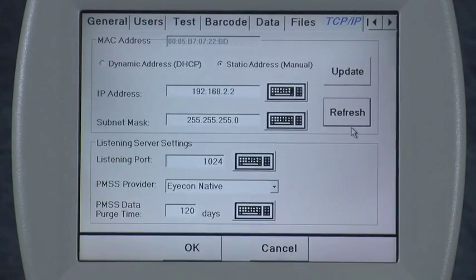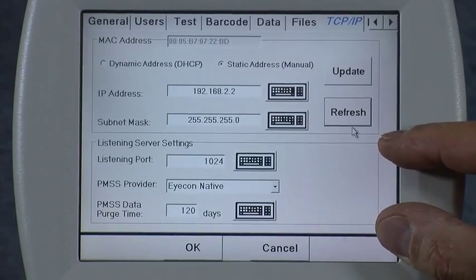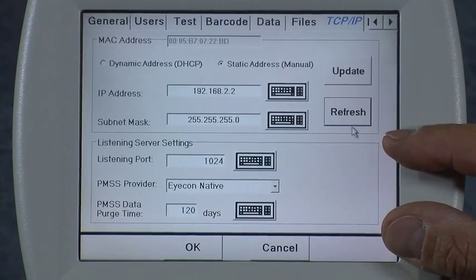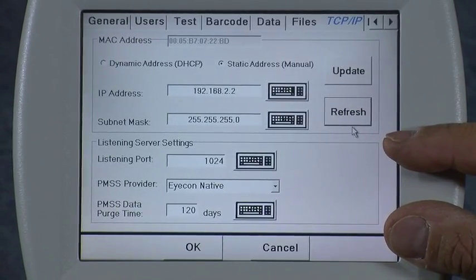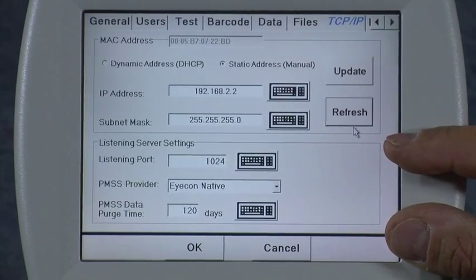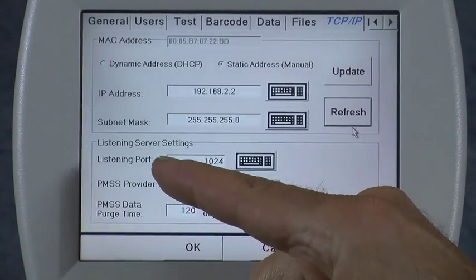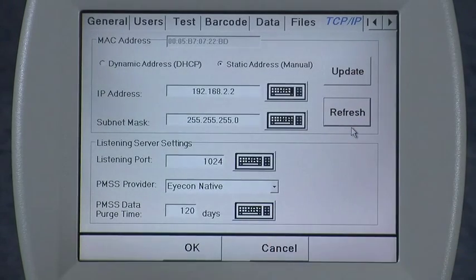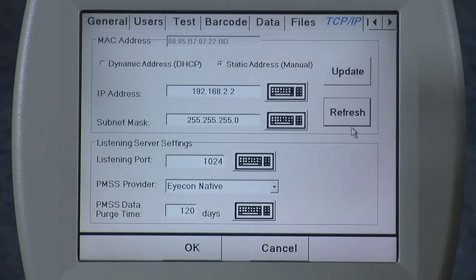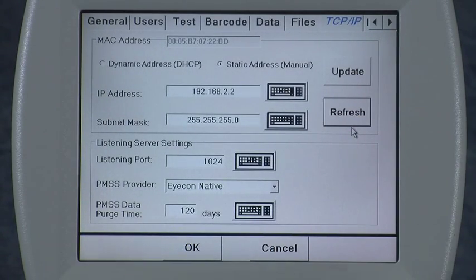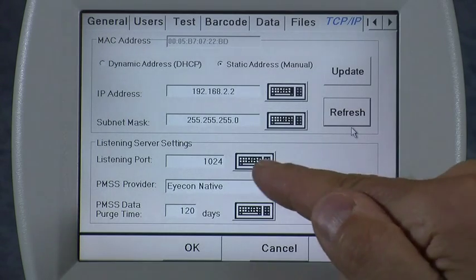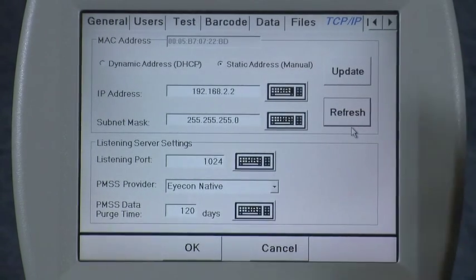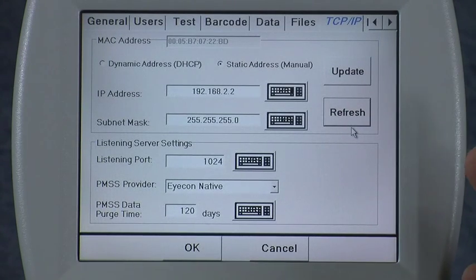Next, the listener port. This setting is only used when you are interfacing the icon with your pharmacy management software. The listener port is the port on the interface that the icon is listening to for packets of data coming from your pharmacy management system. 1024 is the default and works most of the time, but check with your pharmacy software provider to confirm.